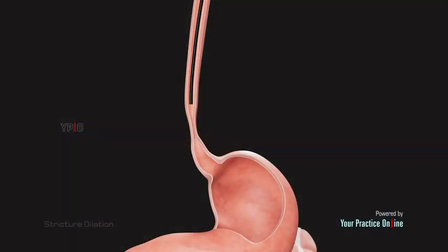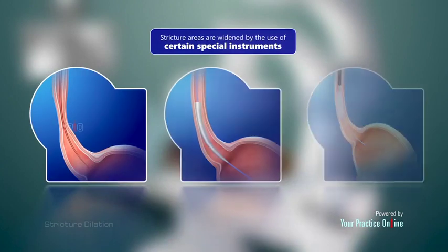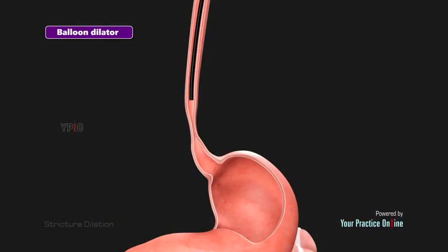Fluoroscopy may be used to create a continuous X-ray image on a monitor throughout the procedure. The stricture areas are widened by the use of certain special instruments that are carefully inserted into your esophagus through your mouth. Different types of instruments can be used for this process, including the balloon dilator. A tiny deflated balloon is inserted into the area of stricture through the endoscope. The balloon is slowly inflated and later deflated when the stricture is widened enough.